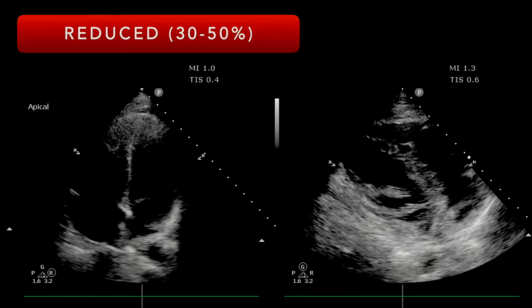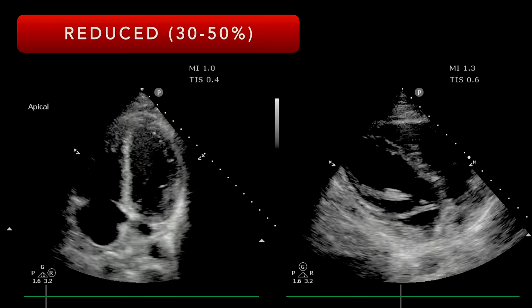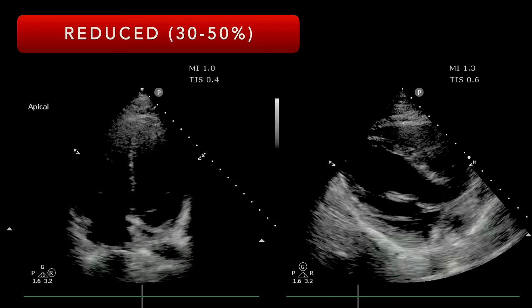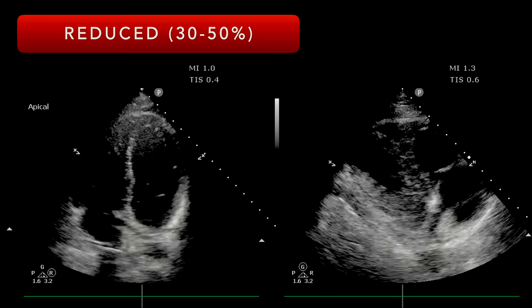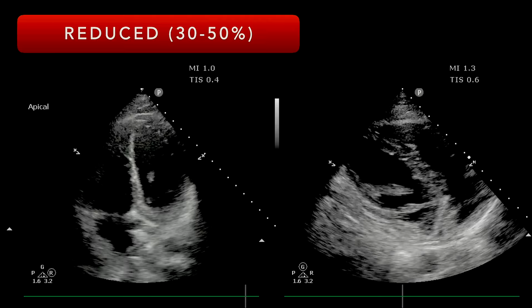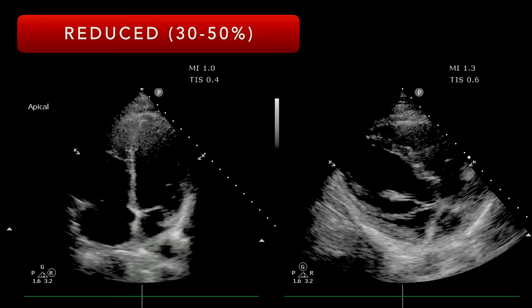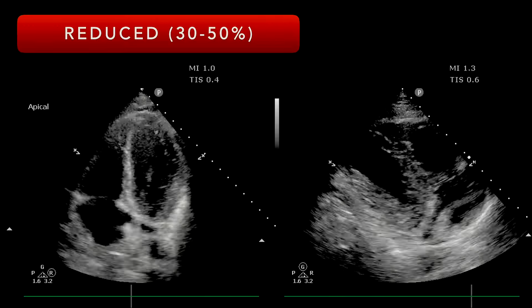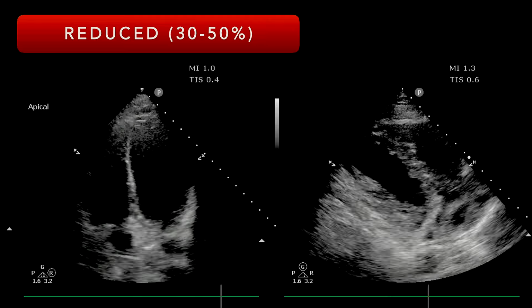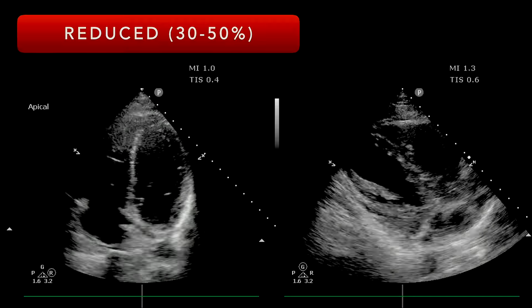And so again, I present these in broad terms, right? I think if you're doing a quantitative measurement, like a Simpson's measurement, you're going to get a number, right? And a lot of machines these days that are coming out on the market have automated ejection fraction estimations in there. They have some method of the Simpson's method that uses AI tools to essentially create or get the images or the clips that you want, and then gives you this number, some of them decently in real time. And so that's helpful, but as we assess this ourselves, we're going to broadly categorize this as normal, then reduced, and then severely reduced. And I think for emergency department purposes, that's probably reasonably fine.